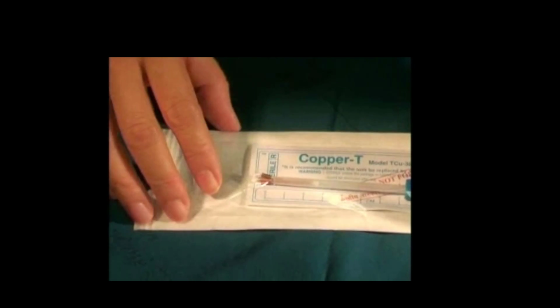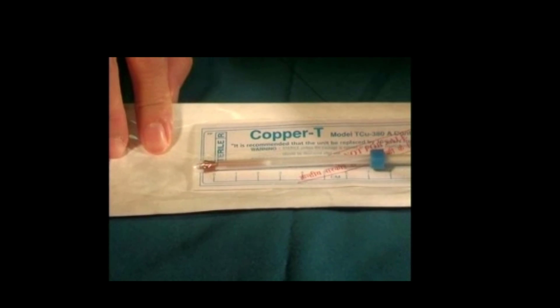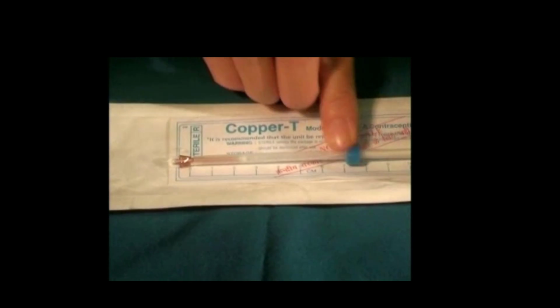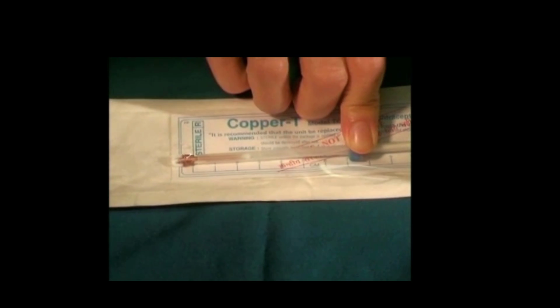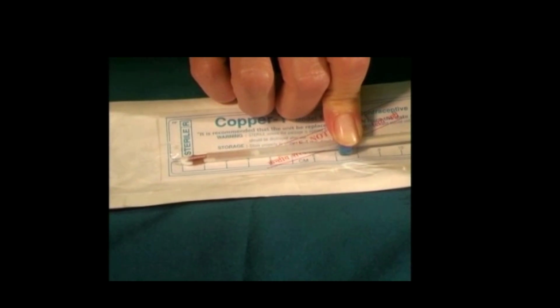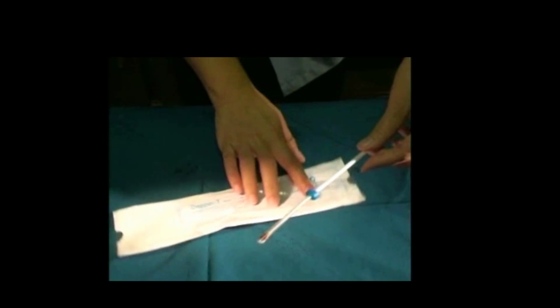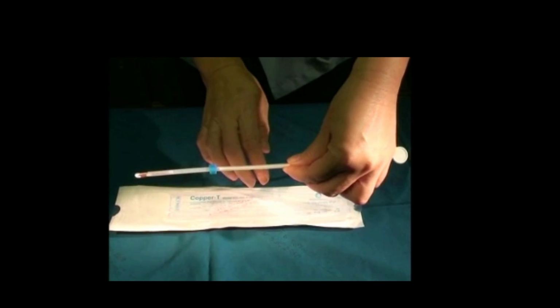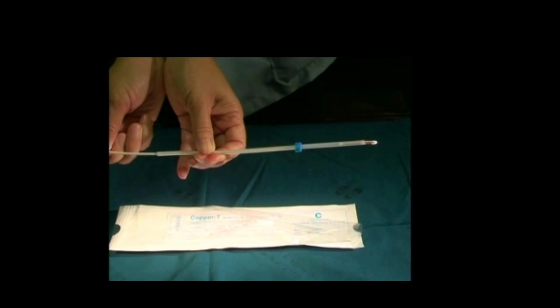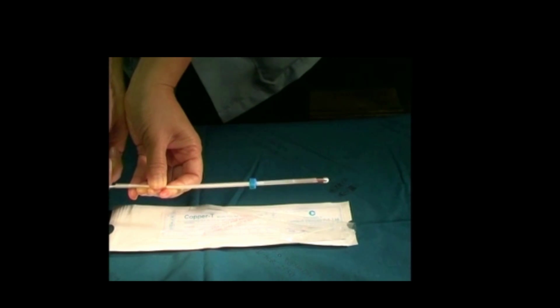Once the IUD is captured, it should be inserted into the uterus within a few minutes. Push the blue flange on the inserter tube to a point that corresponds to the depth of the uterus you had measured with the sound. Remove the loading capsule, but maintain traction on the two strings at the lower end of the IUD to keep the device in position. Introduce the plunger into the inserter tube until it reaches the lower end of the IUD.